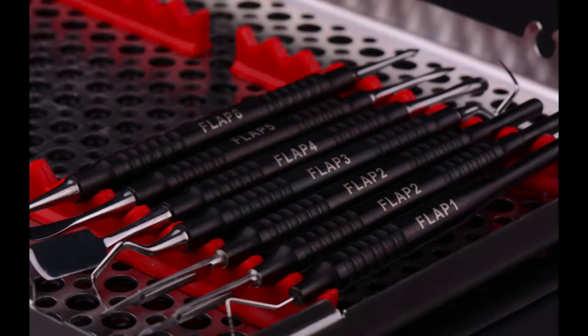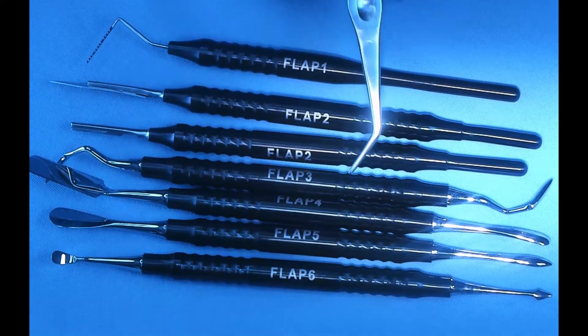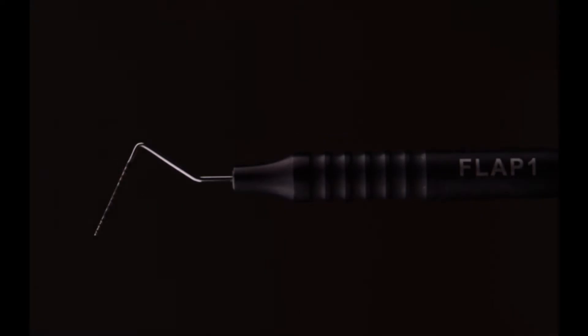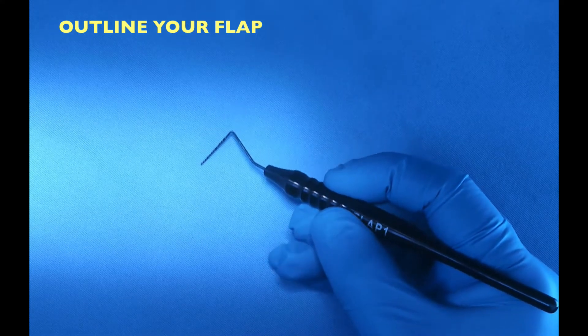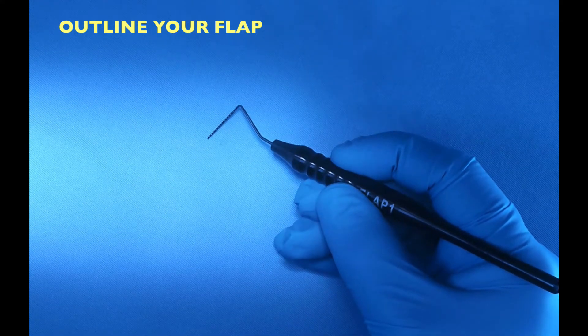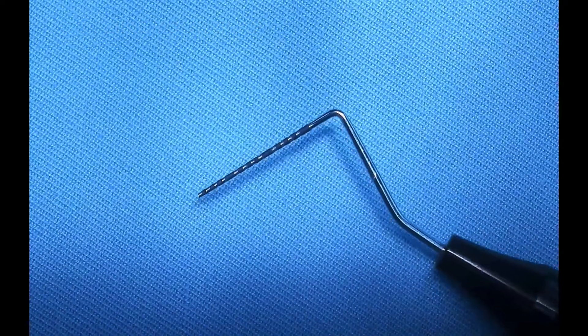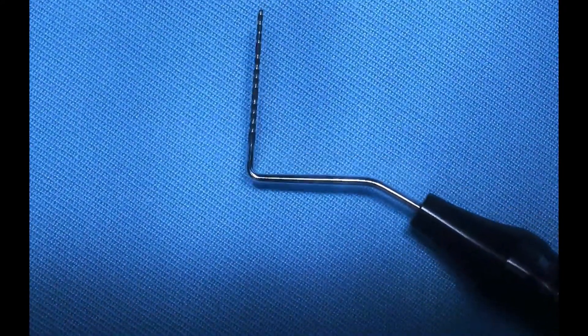Let's start with the flap instruments. I identified six instruments that would help us make the incision and flap design — that's where surgeries start. Instrument number one, I call it Flap One, is our periodontal probe. With that probe I outline the incision, outline the flap that I'm planning. It gives me a visual, it creates some muscle memory — I basically pretend I'm using a 15 blade but I'm only using a probe.